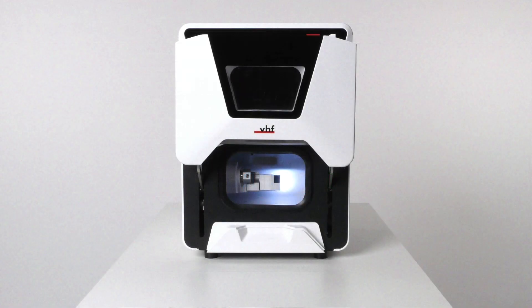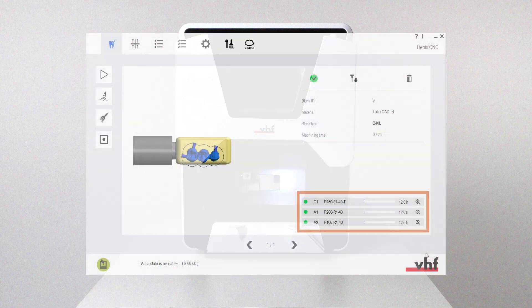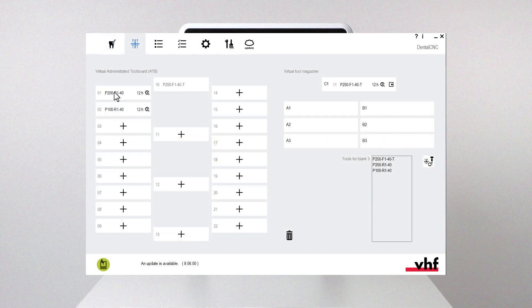The machine requires different tools for the different machining strategies during a job. Dental CNC shows the tools needed for a job in the machining view. Tools are assigned via the virtual tool magazine in Dental CNC.